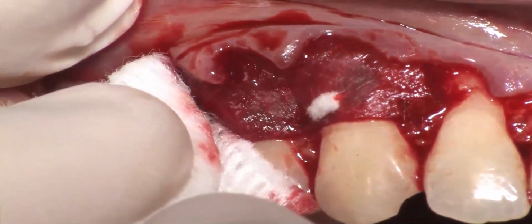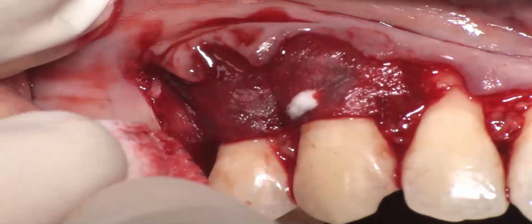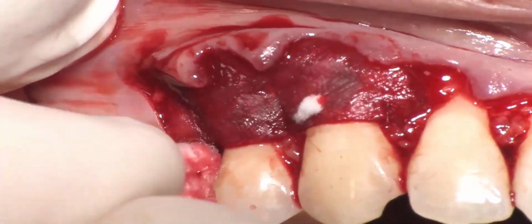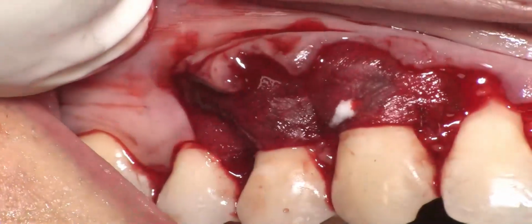I have to see better here the difference between the material and the base of the anatomic papilla.